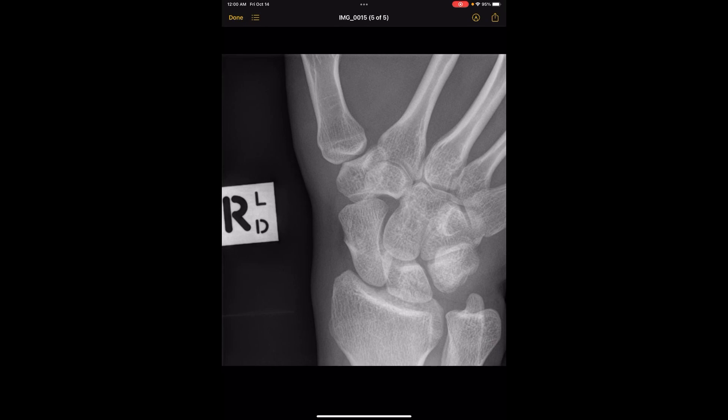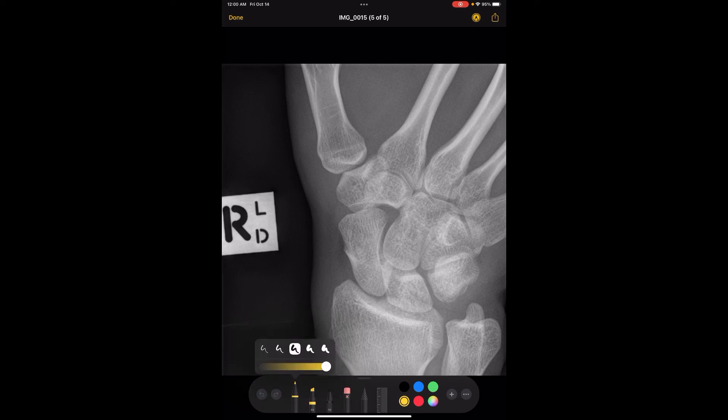The fourth view is the scaphoid view. The scaphoid is a very important bone — it's the most frequently fractured carpal bone. It's also really bad if it does get fractured, because you run the risk of getting necrosis and dying of the bone. So it's very important, and a lot of the times providers will order this extra view to get the scaphoid not superimposed on anything.